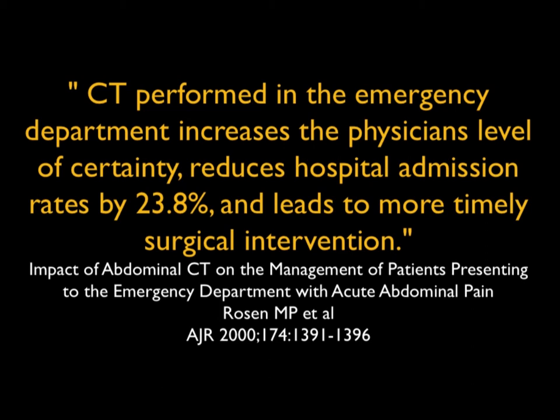Common diagnosis was renal colic, followed by intestinal obstruction. Now look at the results of CT. It altered the lead diagnosis in 49% of cases, increased certainty from 70 to 92%, and the management plan changed in 42%.